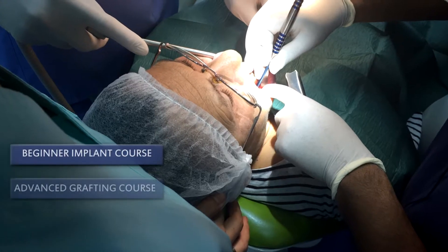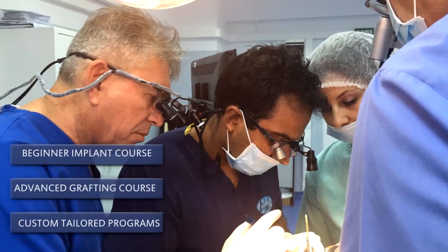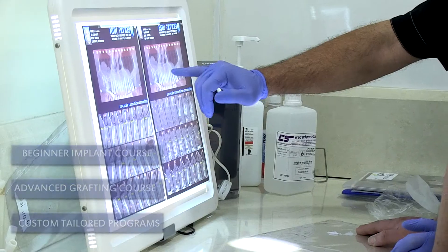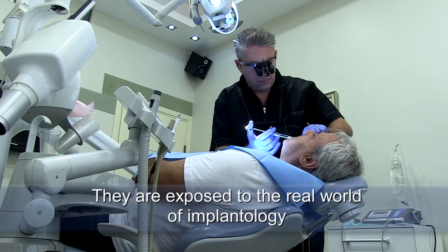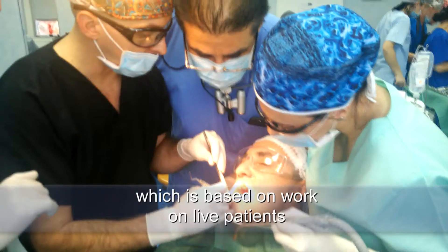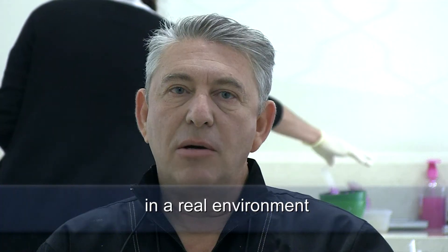Now you have the opportunity to be in one-on-one interactions with the leading surgeons and train under their close supervision. They are exposed to the real world of implantology, which is based on work on live patients in a real environment.